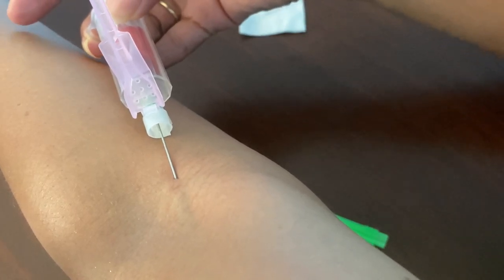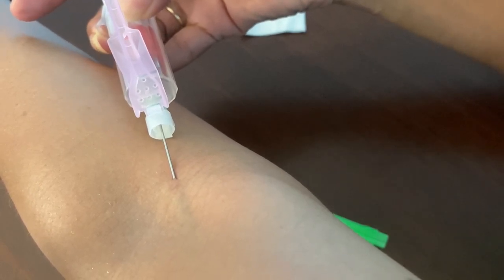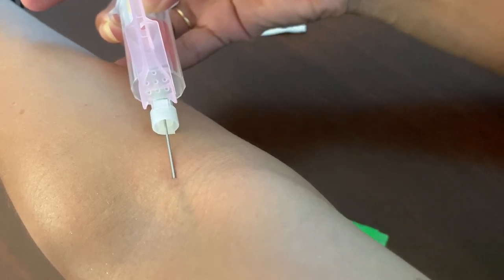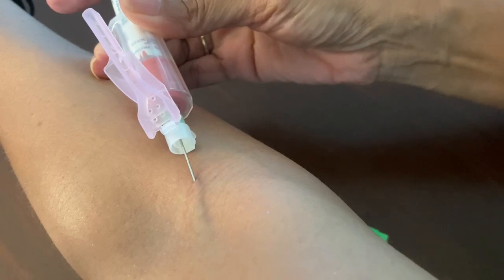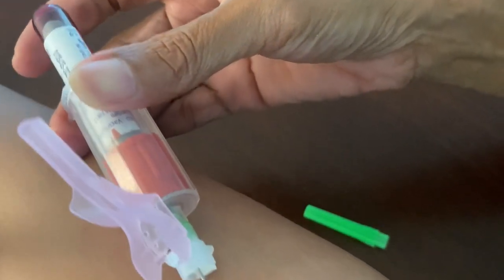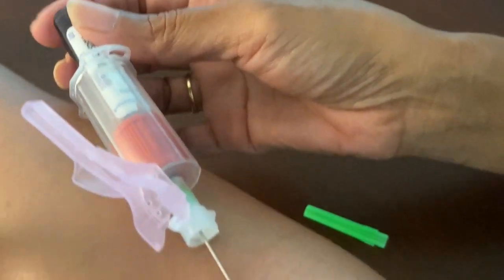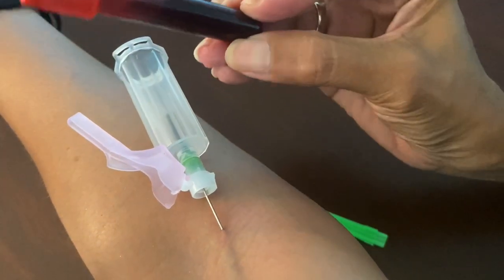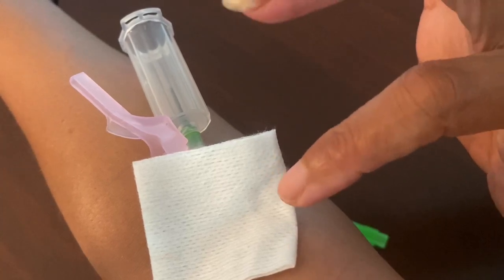Move to the left or to the right without pain, without discomfort. It doesn't look like I'm moving at all, but I am — I'm pulling out and moving the tip of the needle so the patient is almost not even aware of what you're doing, especially if you're keeping them preoccupied. Once you've gotten to that spot you can feel it, and you push your tube because when you first got into the vein you started to get a little blood. That's what a redirect should look like — pull back, then slowly to the left and slowly to the right, and you're going to be successful.